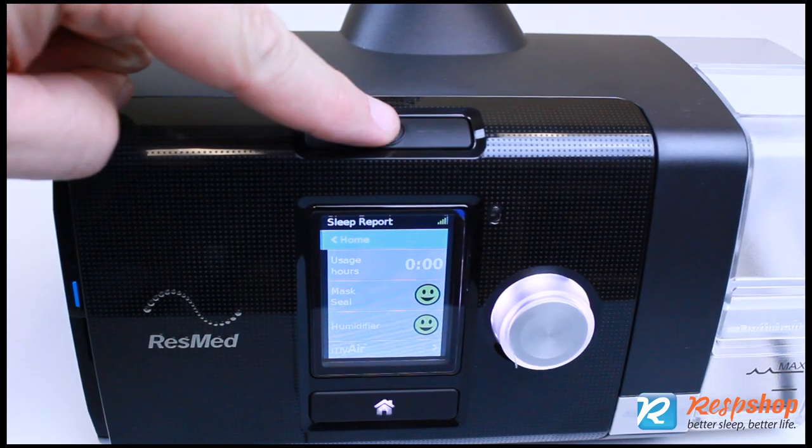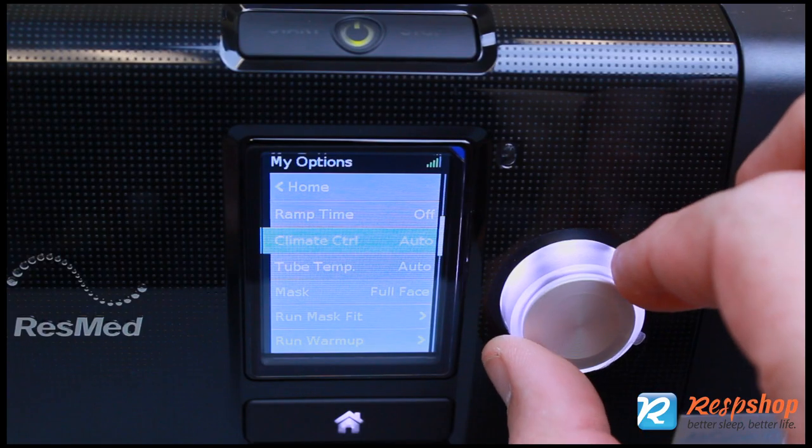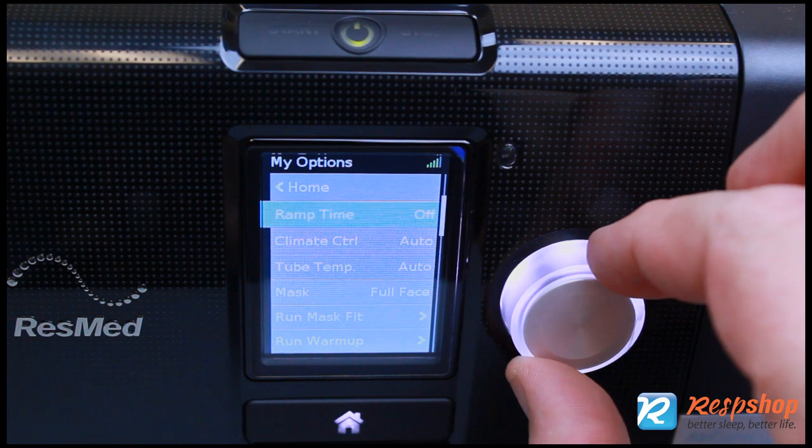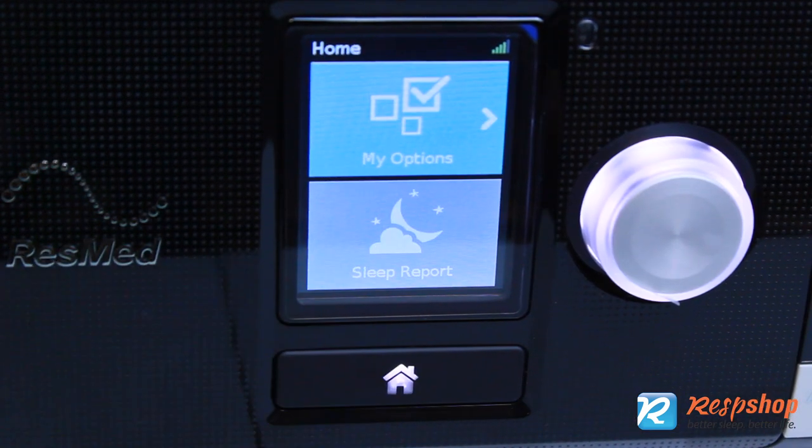Therapy starts and stops by pressing the on-off button at the top of the device. Navigate the menu on the brightly lit screen with the large dial. A front-facing home button quickly brings you back to the main screen.